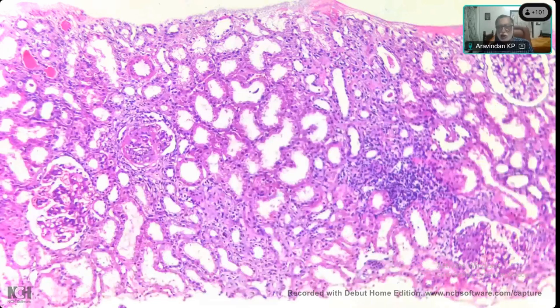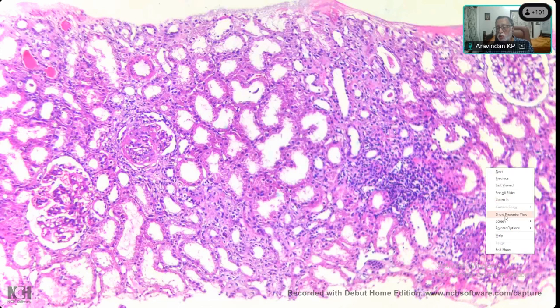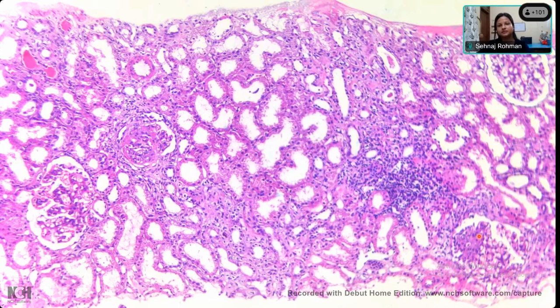Here again you see some interstitial inflammation. There's one sclerosed glomerulus you see here. Yes. Okay. Another intact one. And here what do you see? The tubules are dilated. Okay, I should be using the pointer, no? So here, this glomerulus I'm talking about. Sir, it looks sclerosed, sir. One part of it only. See, this part is sclerosed, this part is normal. So there is segmental sclerosis in this. Yes, sir. Okay.